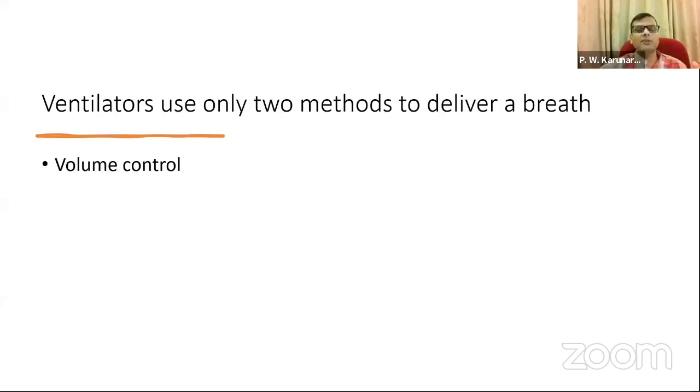The breath the ventilator is giving will use either volume control, where you know the volume, you can set the volume, say 500, 450, 300, whatever the set volume, and exactly that volume will be delivered, so that you can ensure that the patient is getting that volume.